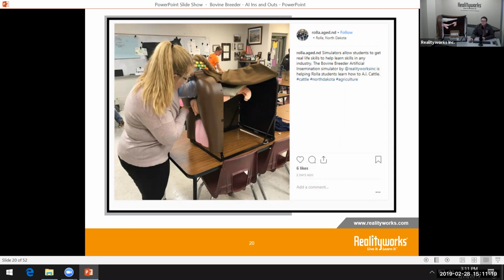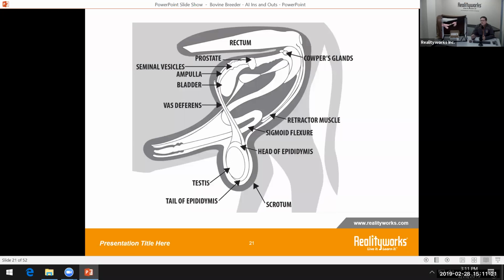gaining the understanding of doing it correctly before they would actually do the real thing. So a lot of what I'm going to be showing you now is actual process or presentation slides and the process of artificial insemination. And I've taken this right from our curriculum, right from the curriculum that comes with Bovine Breeder. We give you lessons on correct insemination technique and walking you through and your students through all this.